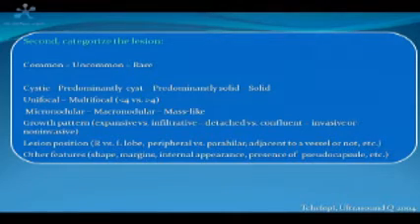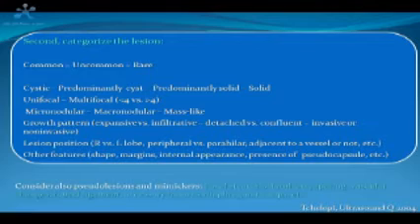Then we have to characterize the lesion. So we must know which focal liver lesions are common and more probable, and we will consider an uncommon or a rare diagnosis only after having ruled out any common diagnosis.